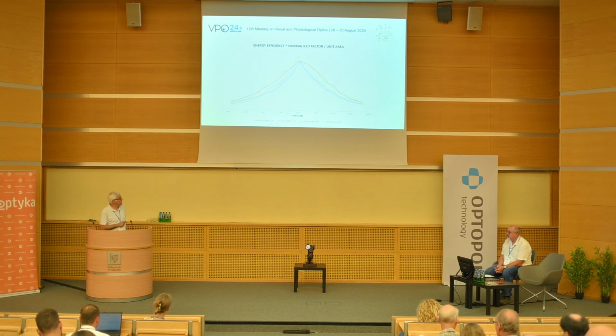And the factors that have an exponent, the two upper ones here, are less peaky and softer around the circle of confusion than the ones without exponent, which have a peaky circle of least confusion. Then it seems that we can have another indicator that accounts for the optical quality and reads like the previous one.